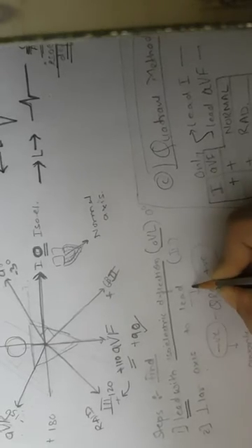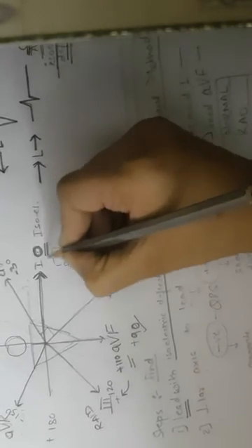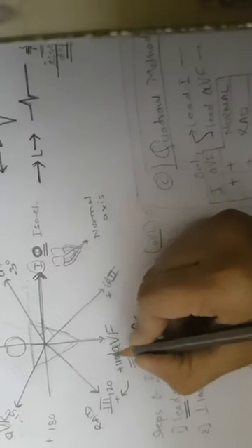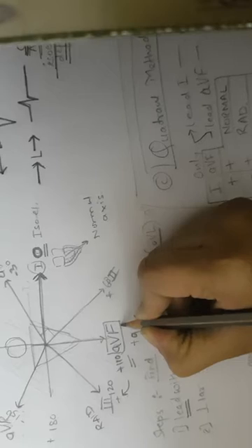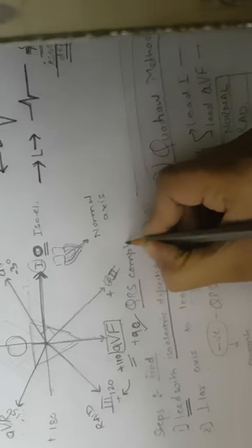Then second, you have to find the axis perpendicular to that lead. The perpendicular axis to lead 1 is AVF. Now in AVF you have to find out what the QRS complex is.